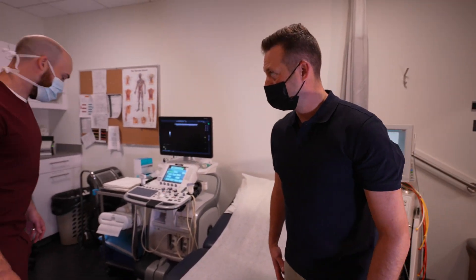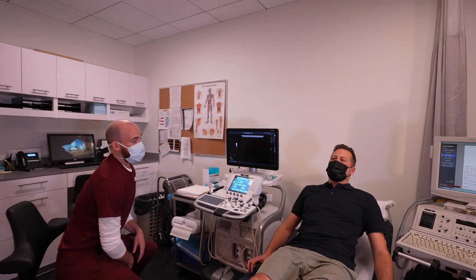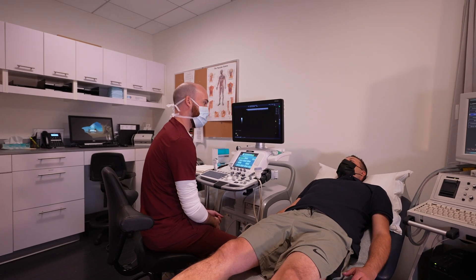When they enter the room they'll be greeted by the sonographer performing the test. There's a separate changing cubicle in each room for the patient, and depending on what test is being performed, you may be asked to change into a pair of shorts.